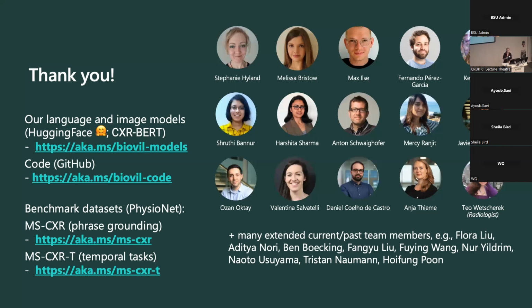These are from the US. She works in the UK. You can clearly tell there are differences. And I've worked with some other US data sets, and you can also see that there are differences. So obviously it would depend a lot on what exactly you are trying to build and how you are trying to use it. An idea that people have with these models is you try and build a general purpose model, and then if a particular hospital wanted to use it, they would fine tune it so it generates the style that people are used to.